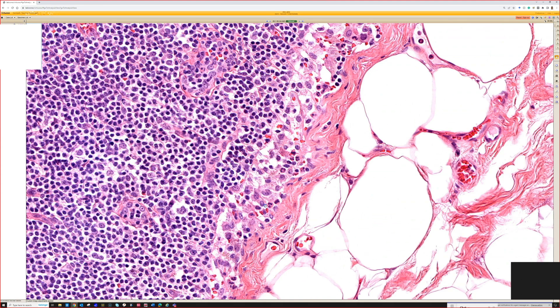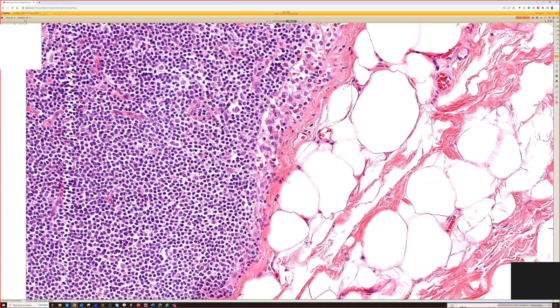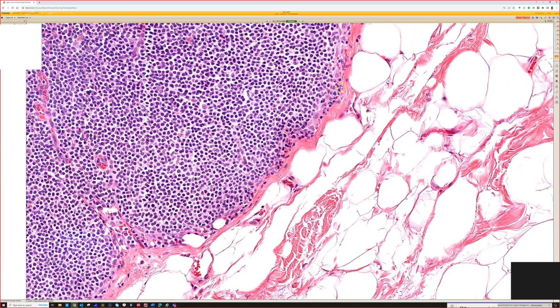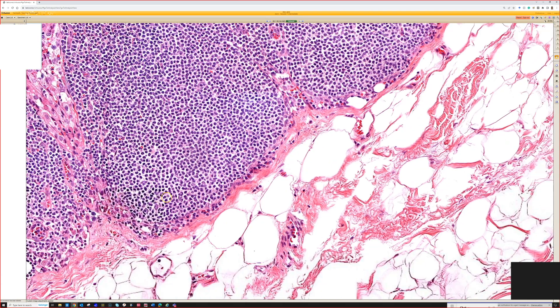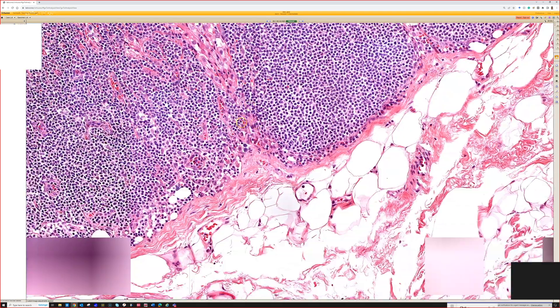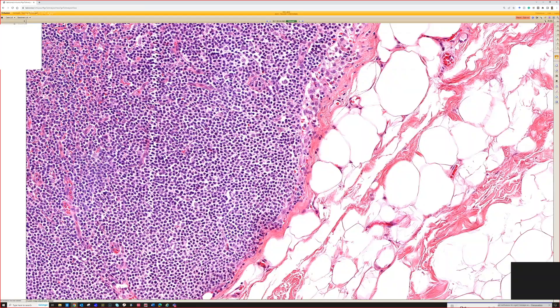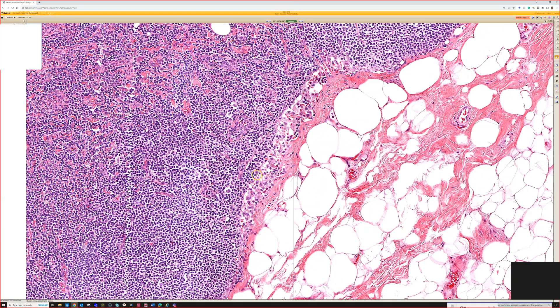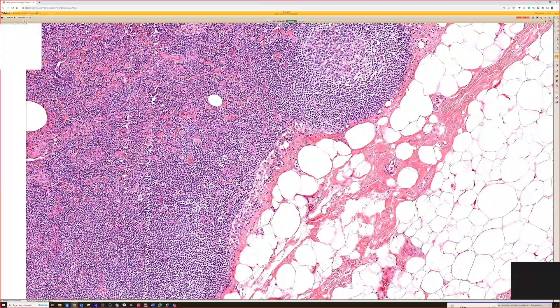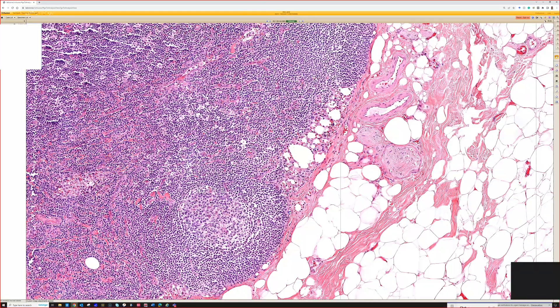So it doesn't have well-defined cell borders - kind of loose aggregates. That's sinus histiocytosis, and it can kind of mimic metastatic melanoma, particularly when you're looking for melanoma, since melanoma cells can have overlap with histiocytes. So it can be a little challenging without practice, and even with practice.